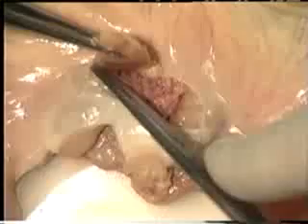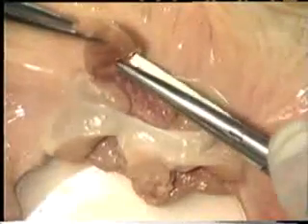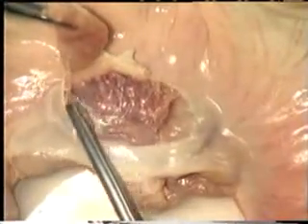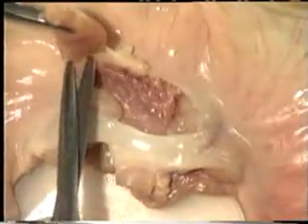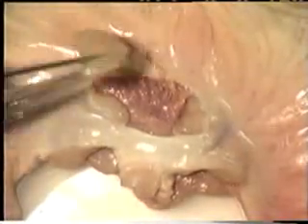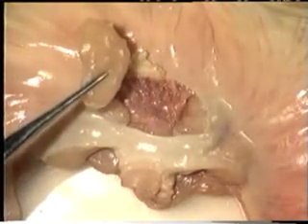The final dissection is performed, revealing the undamaged vessels in the base of the incision. And then the last vessel or leash may need to be ligated or diathermied before the actual node is removed and sent for histological examination.